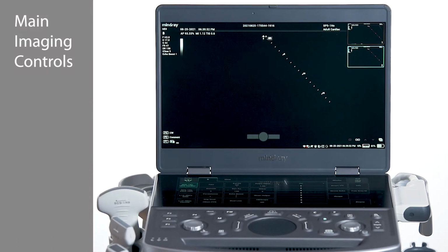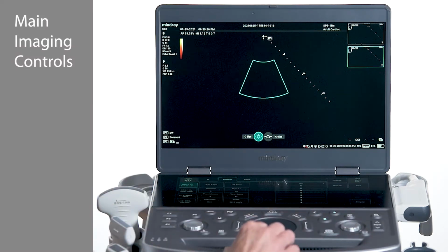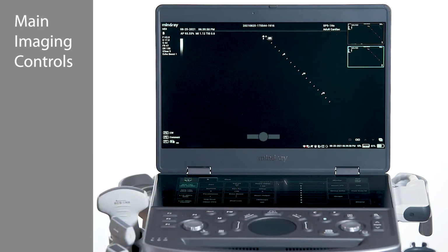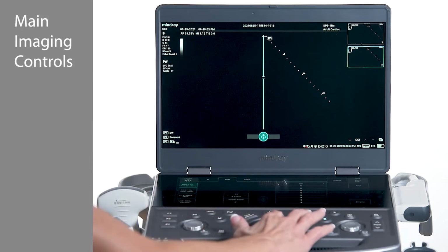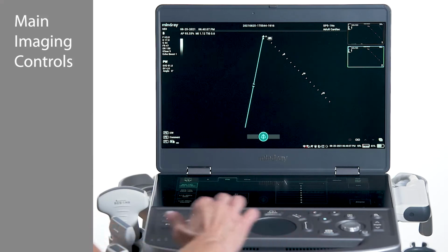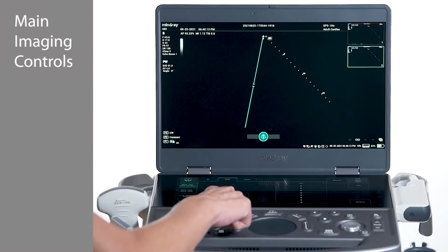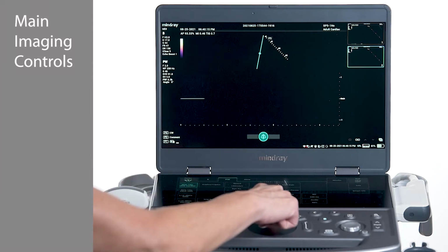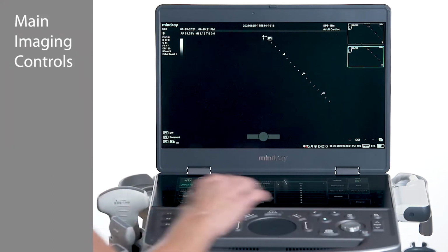To enter power Doppler, press the P key on the right side of the keypad. To enter pulse wave Doppler, press the PW key. Position the PW sample gate in the desired position by using the trackpad. There are two ways to activate Doppler. Press the PW key again, or press the Update key, which is above the trackpad. To exit PW, press the PW key again, or the B key.